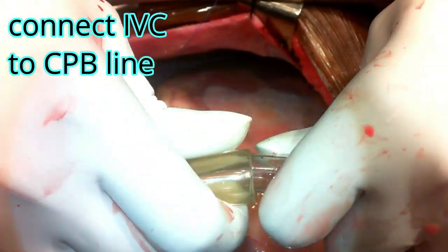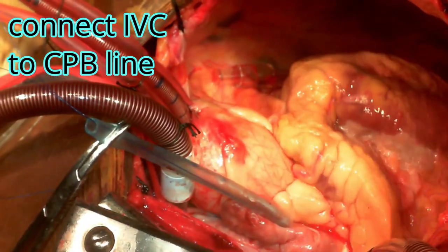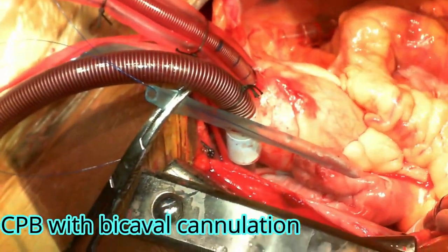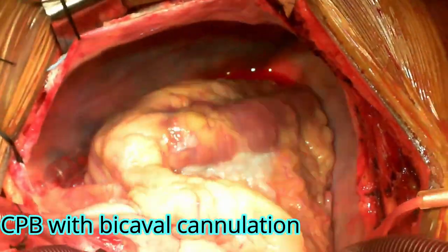Once you open this cannula, you are establishing total cardiopulmonary bypass. The heart is fully collapsed, the pulmonary artery is also fully collapsed — meaning the entire venous return is now diverted to the reservoir.